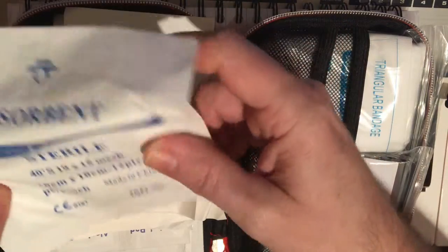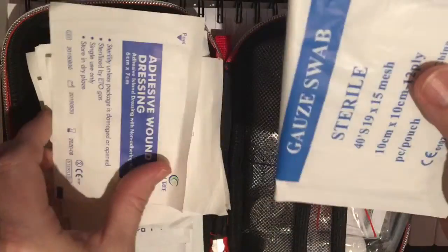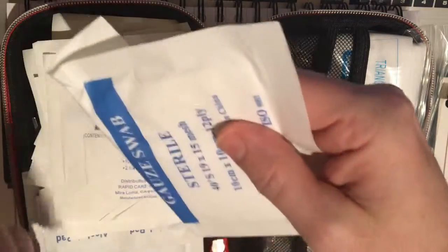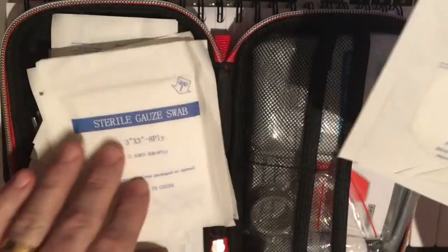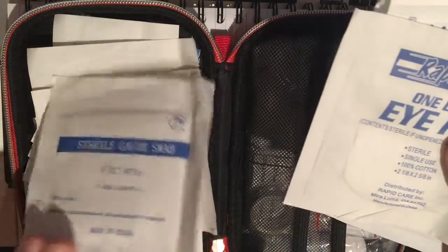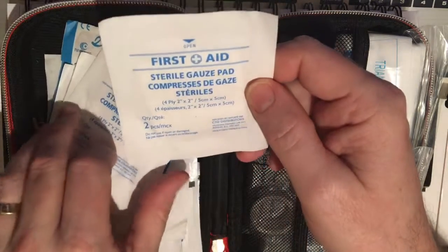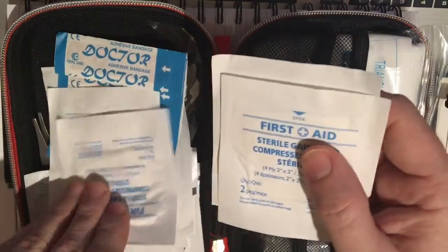We've got a medium to large size gauze, wound dressing, an eye pad, sterile gauze swab, another eye pad, sterile gauze swab. We've also got a smaller two-by-two gauze pad — four of those.